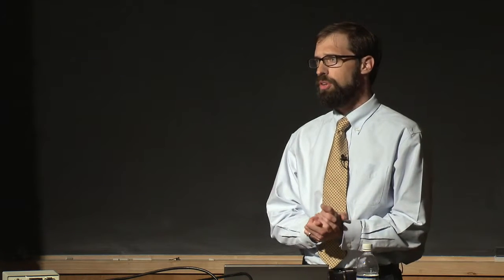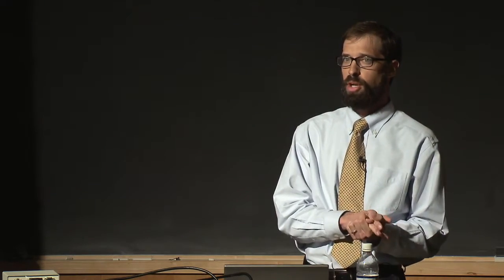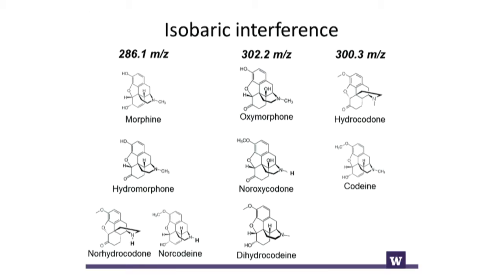LC-MS is not perfect, and I wanted to talk about a couple of the ways that we know it's not perfect, and what I want to brag about is we can tell you when we're not right, or when we can't give you the right answer, and that's what I want to talk about over the next couple of slides. So one problem we have, we're playing the Where's Waldo game again here in our head, but now let's be a mass spectrometer and try to say, where's Waldo? And the answer is, some of these molecules have the same precursor mass, and some of these molecules have similar fragments to one another.